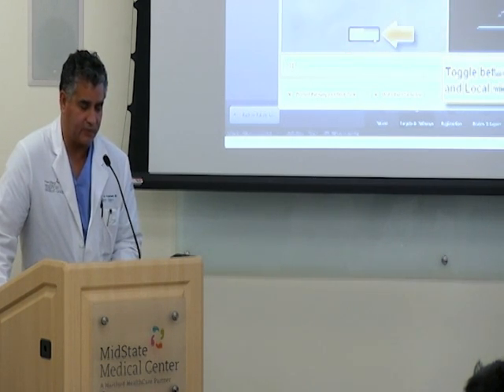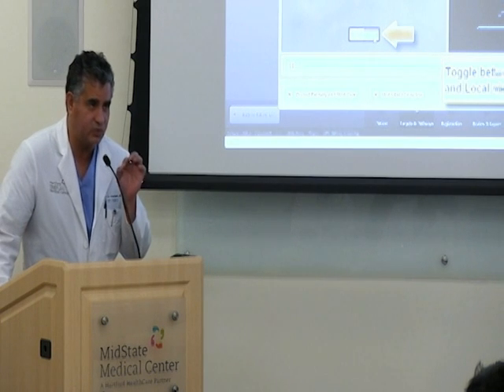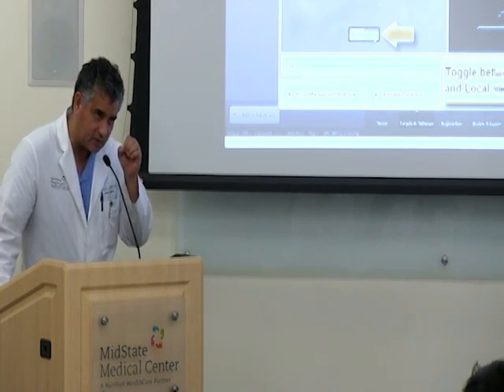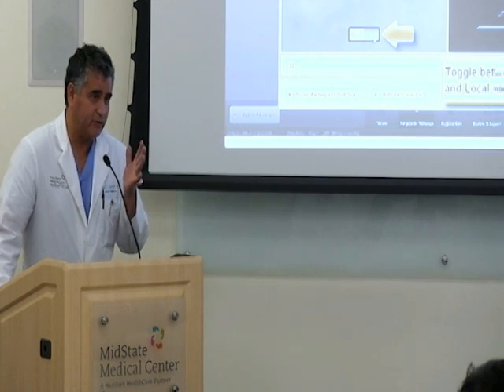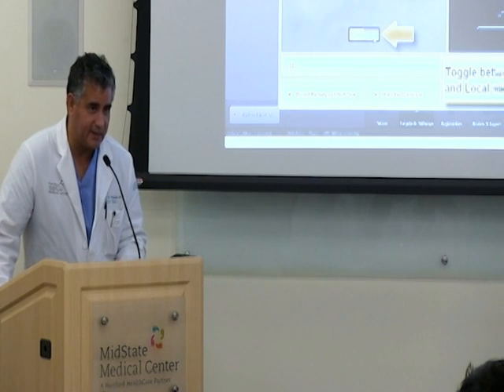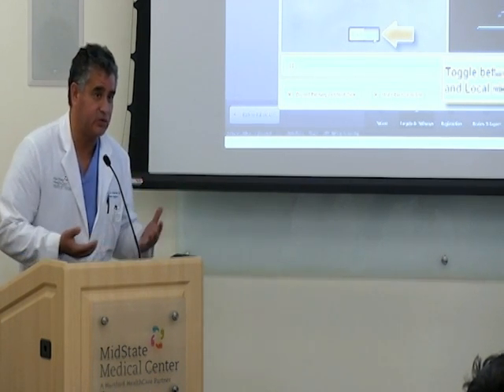So the other thing I think that's very important to notice, you saw how this screen here just flipped from an inside view to a more virtual view. And that's because we switched from a part of the bronchus that we can actually see through the bronchoscope to one we're not going to be able to see, and where we're going to have to put a special steerable catheter out guided by this GPS system, which is essentially why I'm calling it a GPS for the lung.